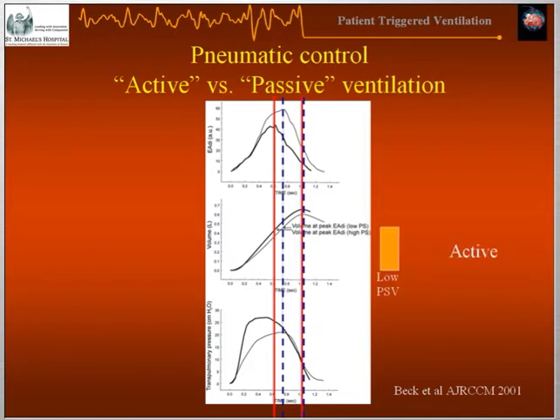If we look at the inspiration that is actually performed during low pressure support ventilation when the diaphragm is active, this is how much ventilation we get, that's the volume. If we compare with high pressure support, we get less active activation, but there is not much difference. Now, the passive part of the inspiration, we call it passive, we don't have a better word.